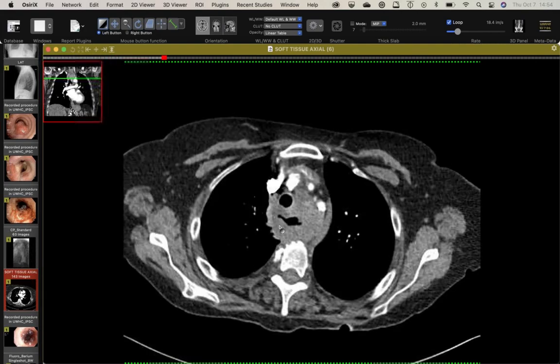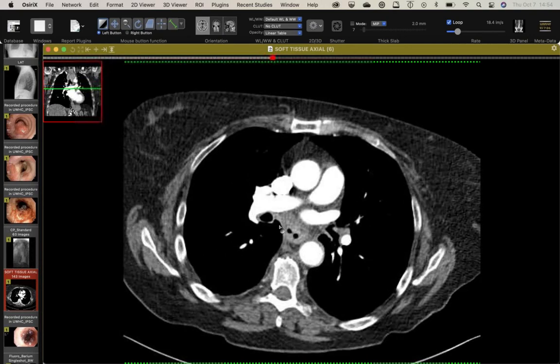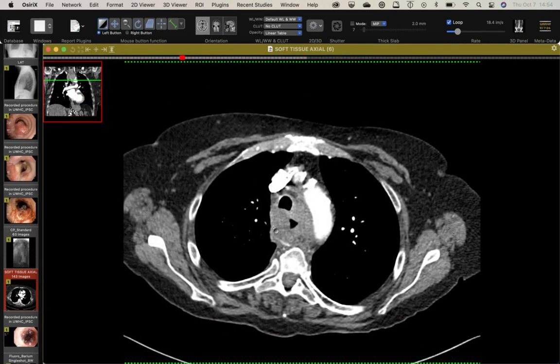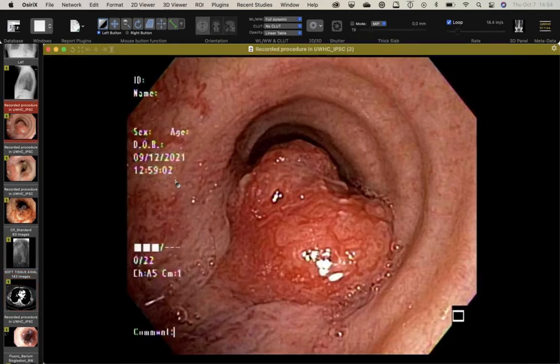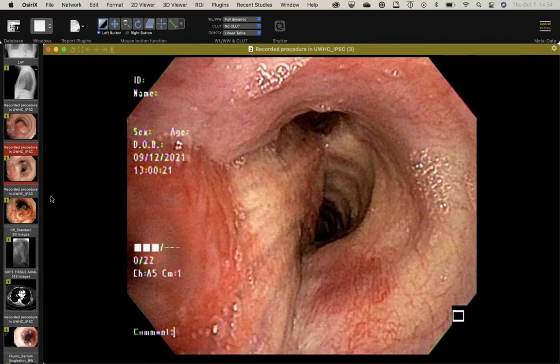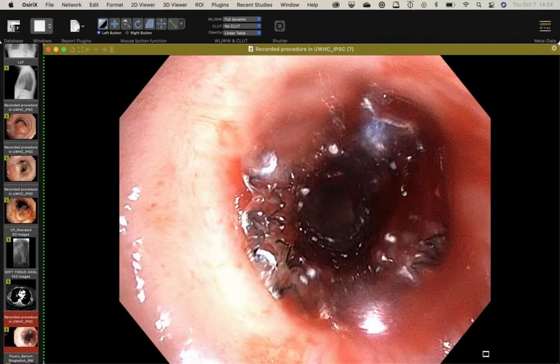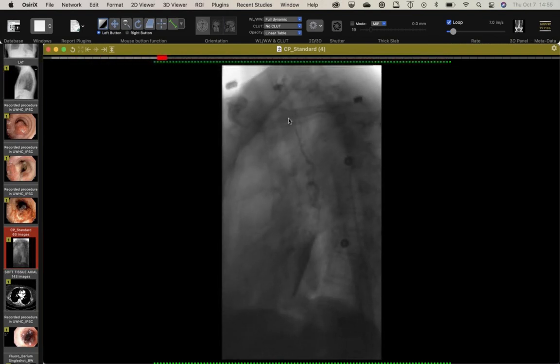And this looks like primary esophageal cancer. It was biopsied and indeed is a squame. It's quite extensive. It goes down quite a long ways. And because of that hemoptysis, they did a bronchoscopy and you can see this is the mass in the actual airway of the trachea. And so the interventional pulmonologist kind of debrided a lot of it just to debulk it. And then they ended up putting a stent across it here to just prevent the fistulization, at least temporarily.